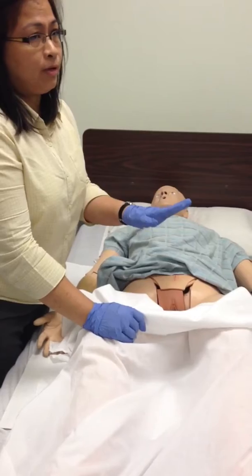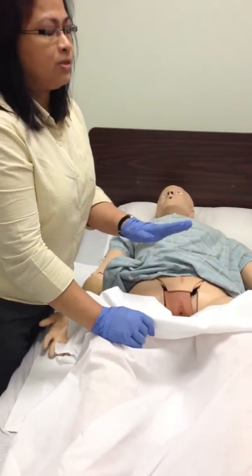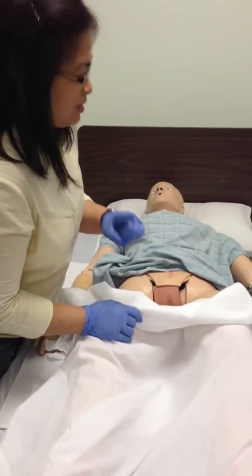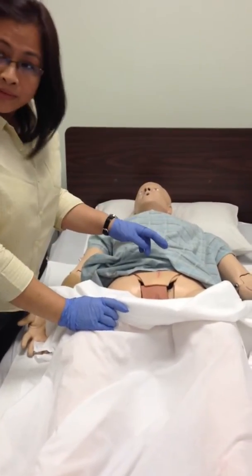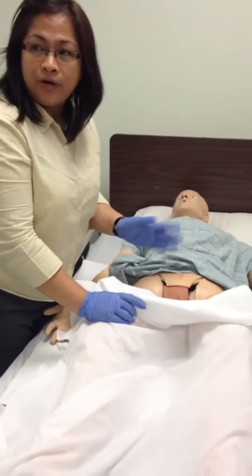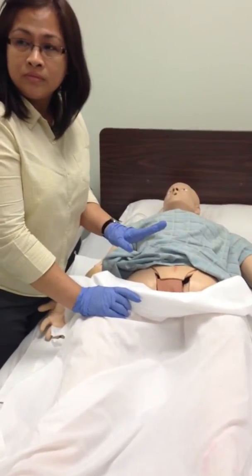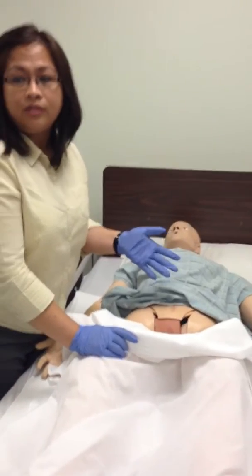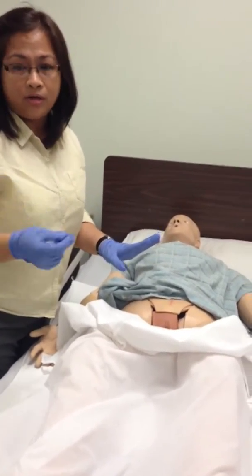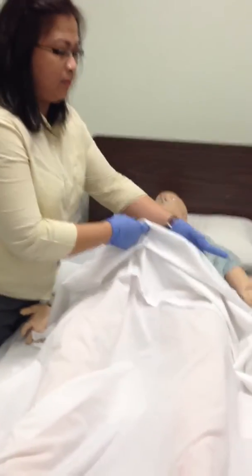Okay, so it's above the symphysis pubis. Distended bladder, what are we going to do? You still have to use the catheter. If it's not distended, anyway we do it, because there's an order. You just need to remember, all right? And you have to take note. You have to document it. Very good, sir.